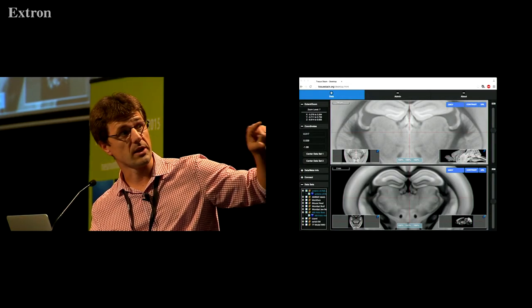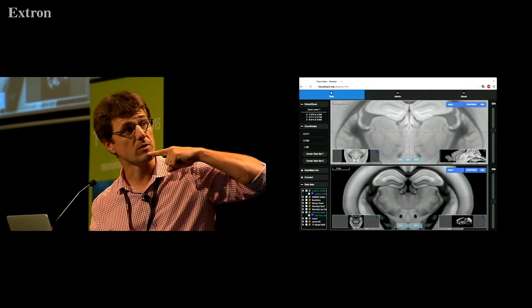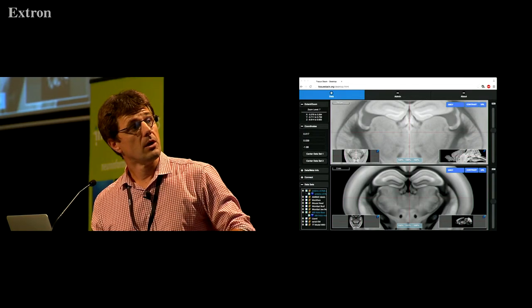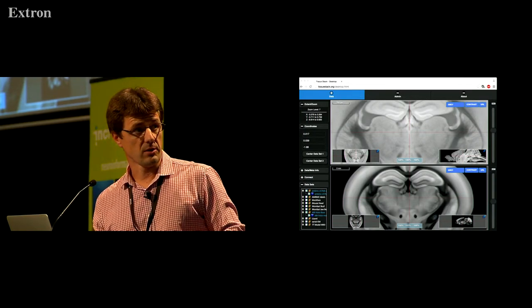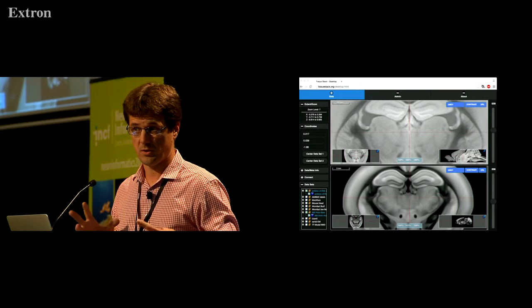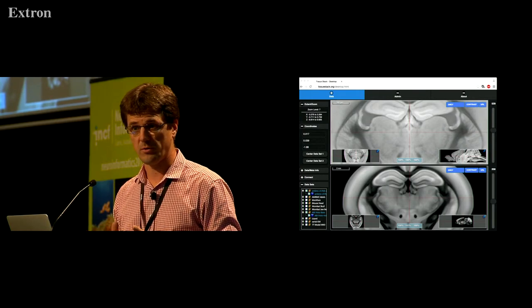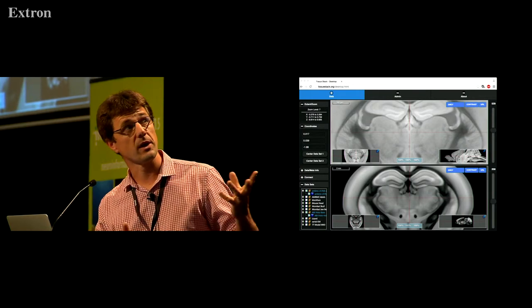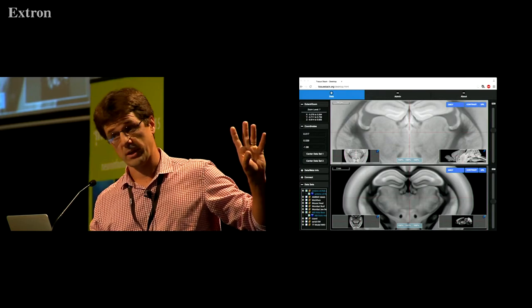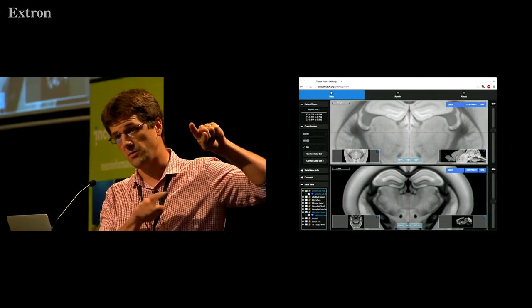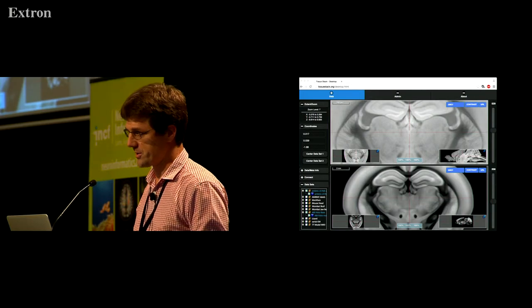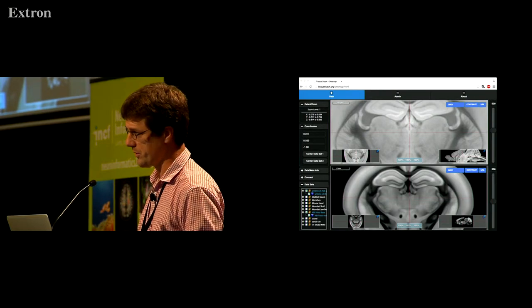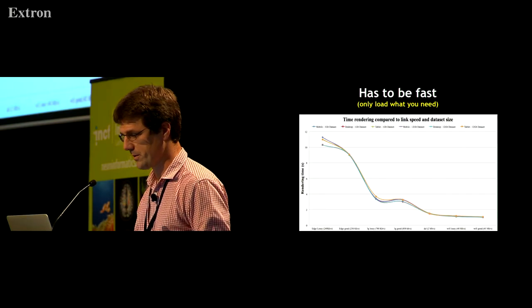I got in trouble from the university for downloading a large number of their image data sets, and I produced one of these morphometric averages. We realigned this with our MR data at the top. It means if you browse through these points, the two views will follow each other because while they're different resolutions, we use the same coordinate system for both.